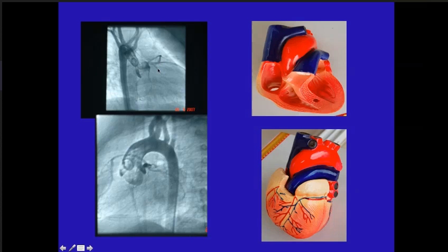Okay. Now what does it show? It shows anomalous coronary. Oh, come on. After angiogram, anomalous coronary. Then what is right sided aortic arch? Okay, now let's talk of coronary. I've shown you this angiogram already here. I've discussed right aortic arch, aberrant subclavian artery, everything I've discussed already. What is a coronary? Describe the coronary for me.